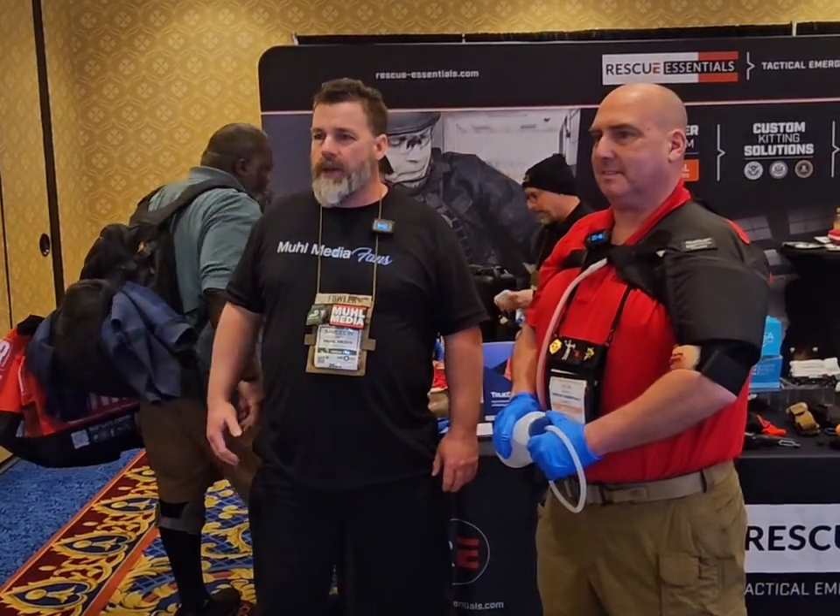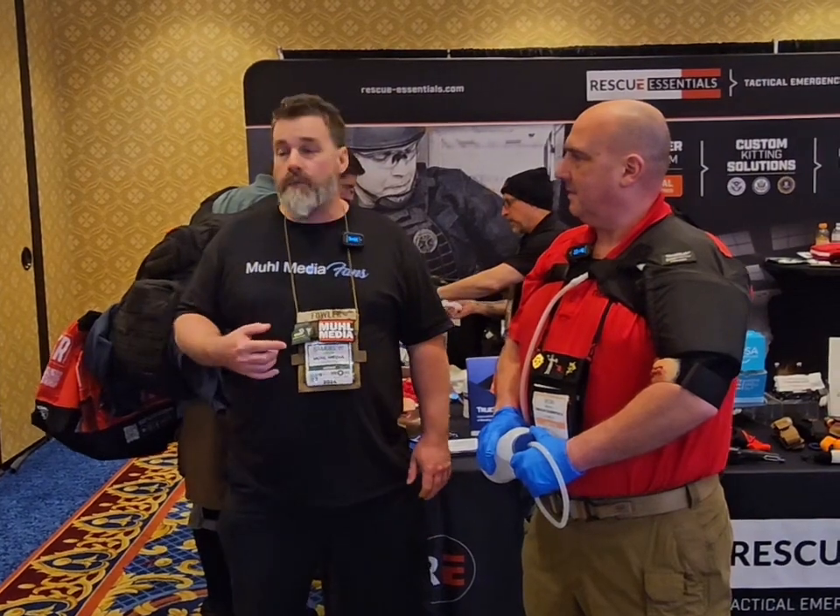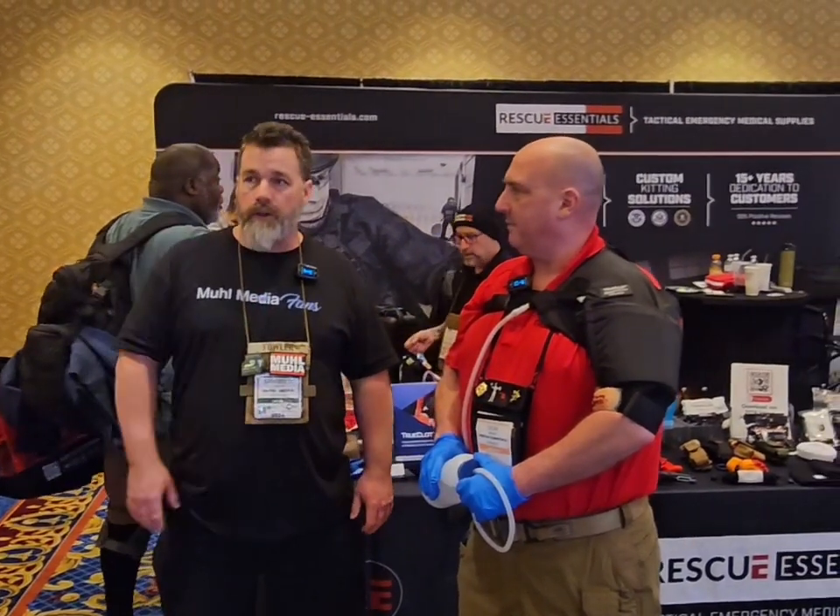Hey everyone, it's Sam with Muhl Media. I'm out here at SHOT Show 2024 at the Rescue Essential booth, and I've got Ron from True Clot who's going to show us the tourniquet trainers.